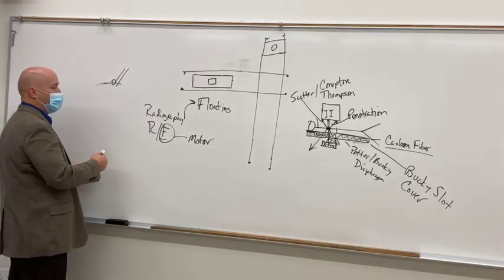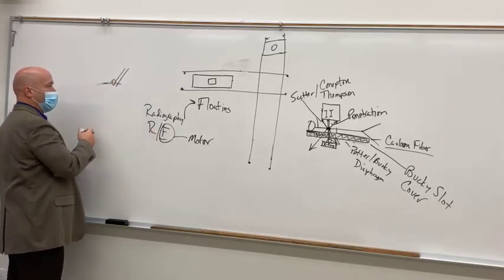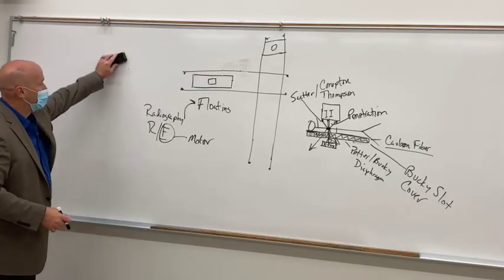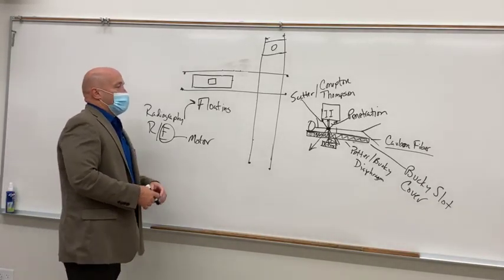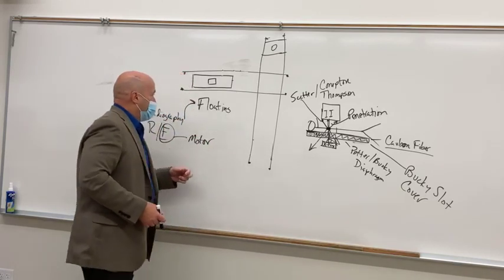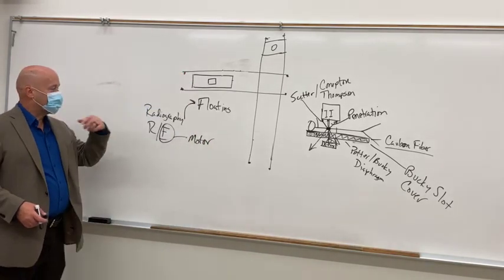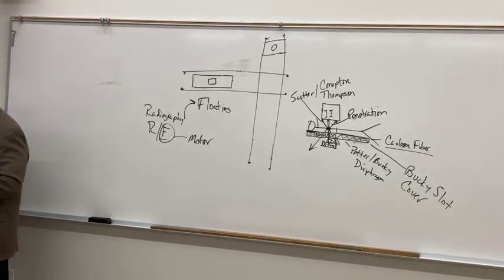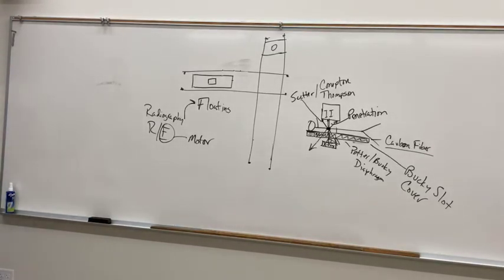So the motor-driven tables are in your fluoroscopy rooms to prevent that, or any of those other problems that I was talking about before. So tabletops can be floating or motor-driven. Floating are going to be your diagnostic, your radiography, and then your motor-driven will be your RF rooms. Okay? Any questions on that?